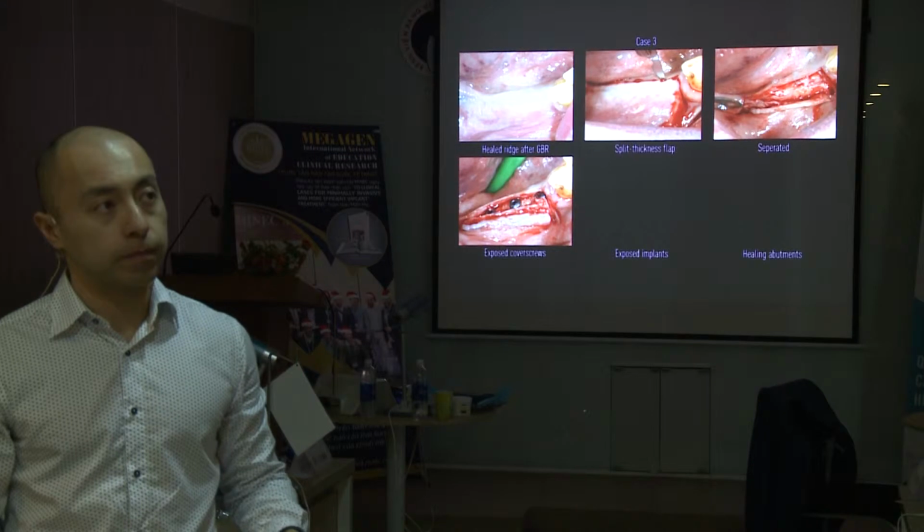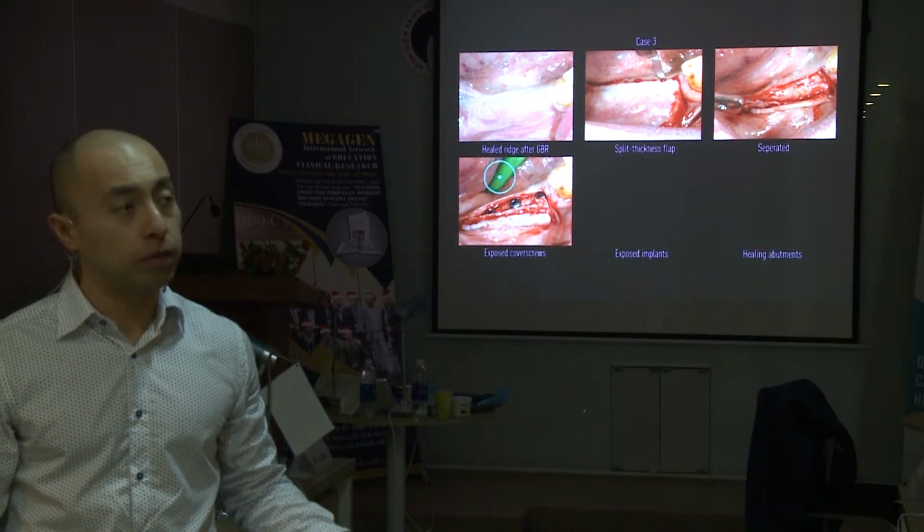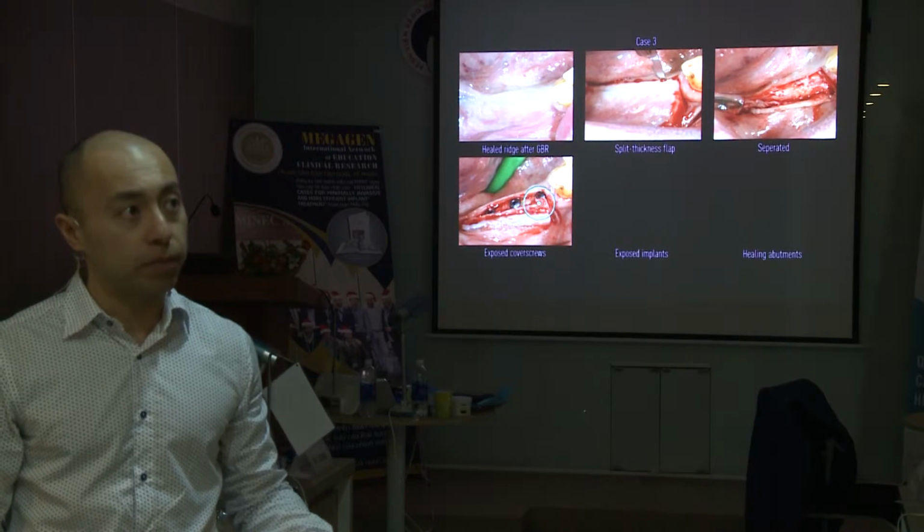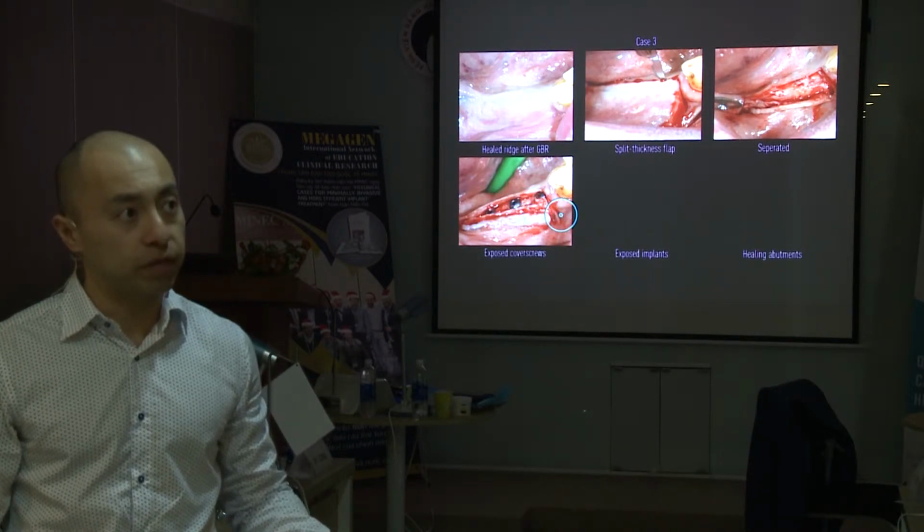And then I expose the implants with a cut on the bone. And this is the periosteum and this is the split soft tissue.